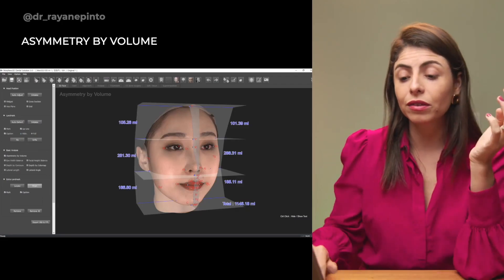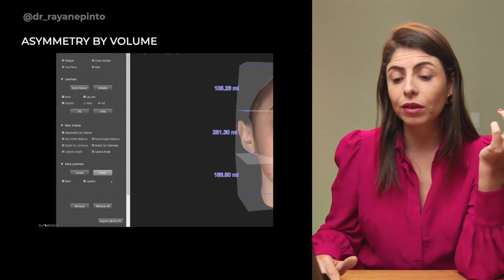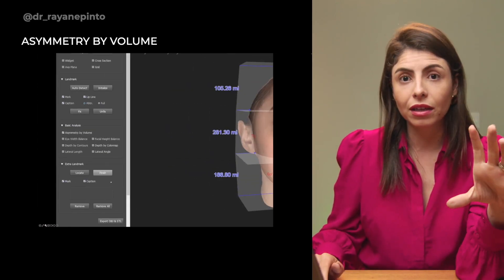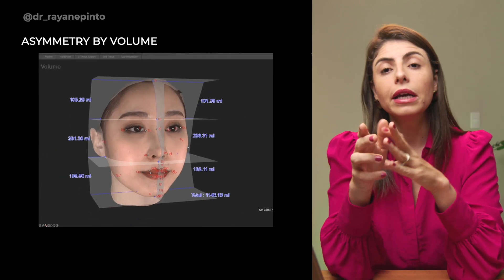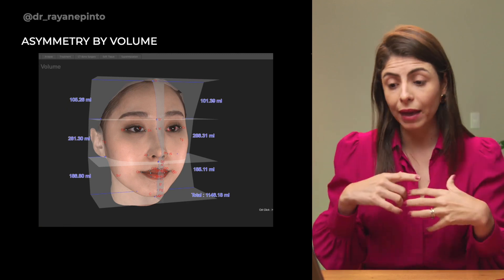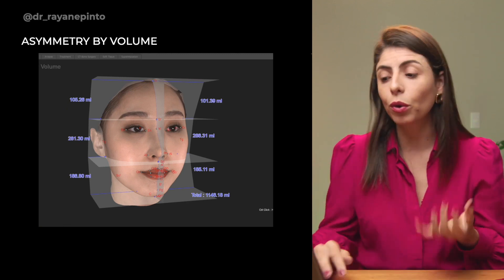When your patient is asymmetrical, you can use the asymmetry-by-volume function. You can come here and perform a volume analysis of the patient's right and left sides, as well as by facial thirds. That way, you can check if your patient is truly asymmetrical or not.